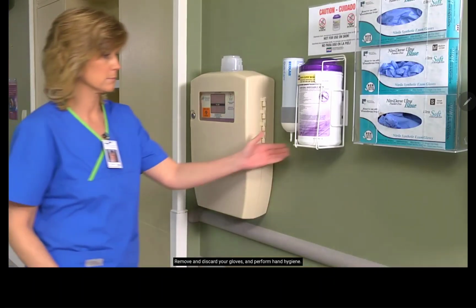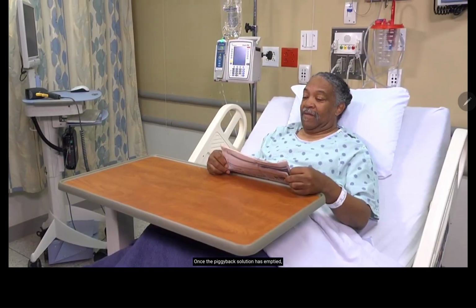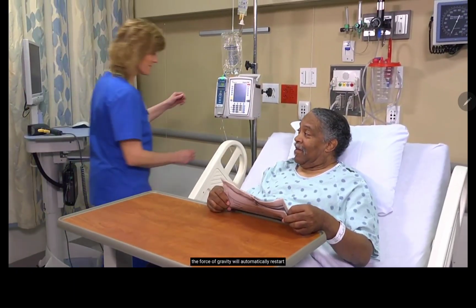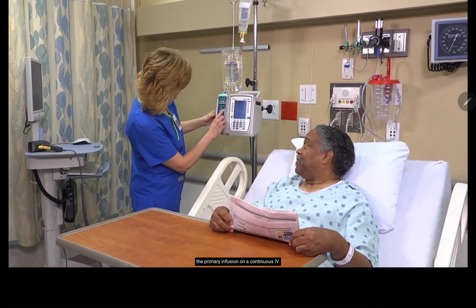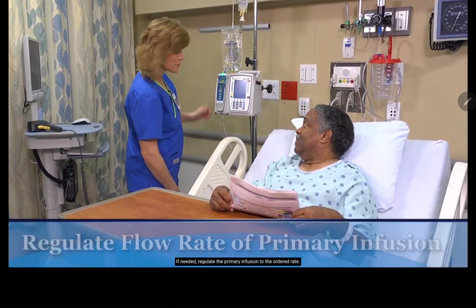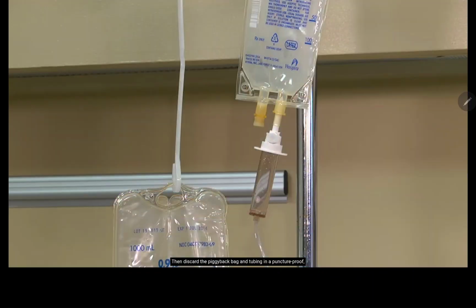Remove and discard your gloves and perform hand hygiene. Once the piggyback solution has emptied, the force of gravity will automatically restart the primary infusion on a continuous IV. If needed, regulate the primary infusion to the ordered rate. Then discard the piggyback bag and tubing in a puncture-proof, leak-proof container, or leave them in place so the tubing can be used again with the next piggyback infusion.